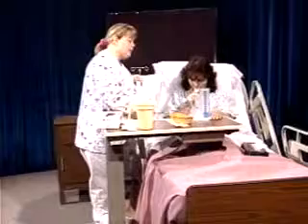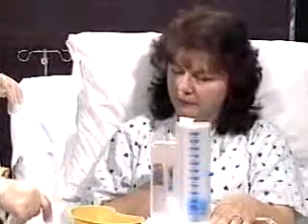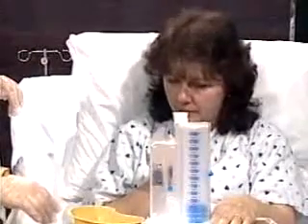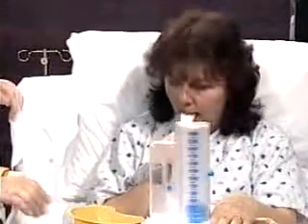Have the patient hold her breath and count to 3. Make sure the ball on the right elevates and stays between the ends of the bracket to ensure proper inhalation. After a deep inspiration, have the patient remove the mouthpiece from the mouth and exhale normally.